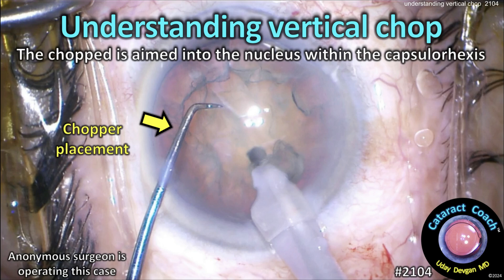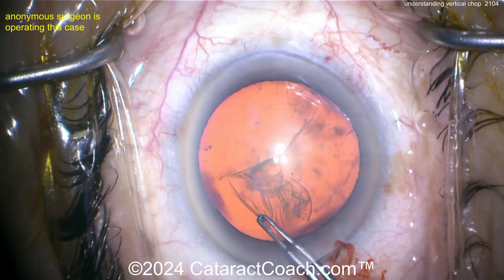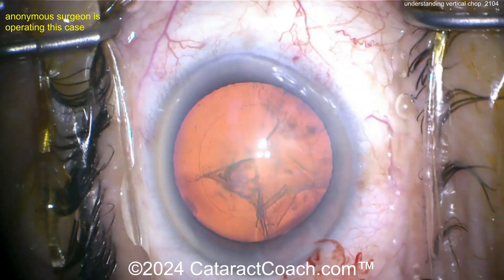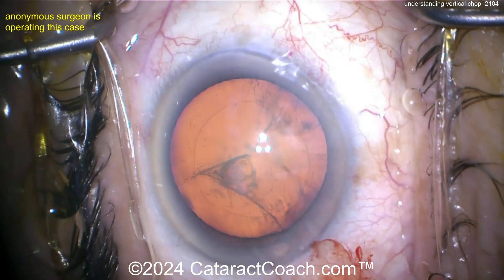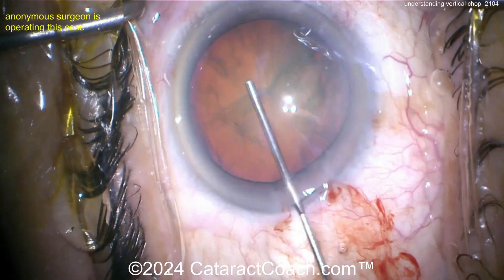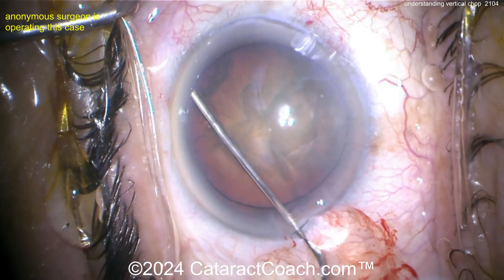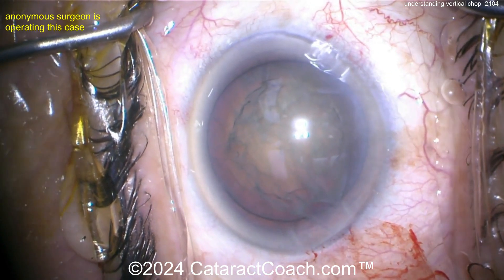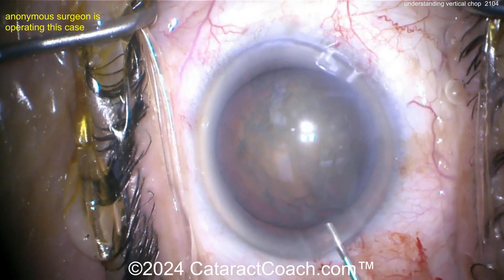CataractCoach.com — understanding vertical chop. The chopper is aimed into the nucleus and within the capsular rexis. The rexis is complete here. After replacing instruments and doing a little hydrodissection, the key difference is where the chopper is placed. In vertical chop, the chopper does not go around the capsular bag equator like in horizontal chop — the chopper stays within the confines of the rexis.